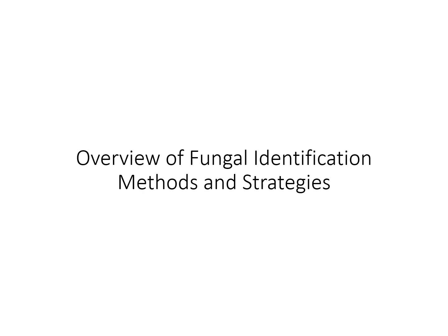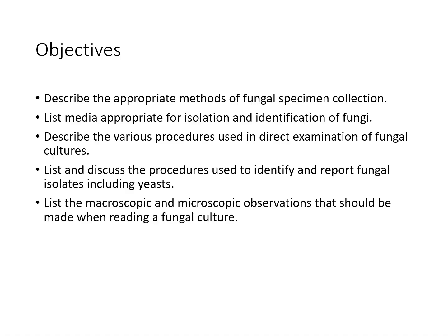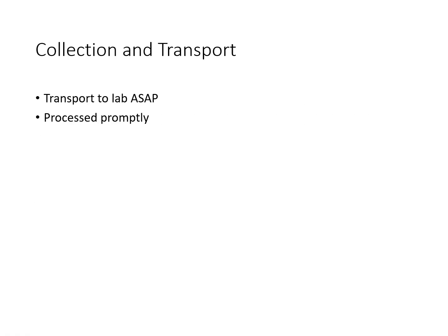An overview of fungal identification, methods, and strategies. So, fungi collection and transport. The importance of proper collection and transport helps to ensure accurate identification and diagnosis, preserves the viability and morphology of fungal specimens, and prevents contamination or overgrowth by other microbes.